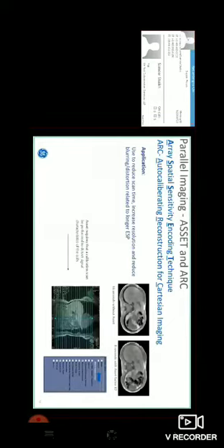Assume this is abdominal imaging and this is your FOV. You can see this area and this area have the same phase. But the scanner or the system only knows where the frequency is.